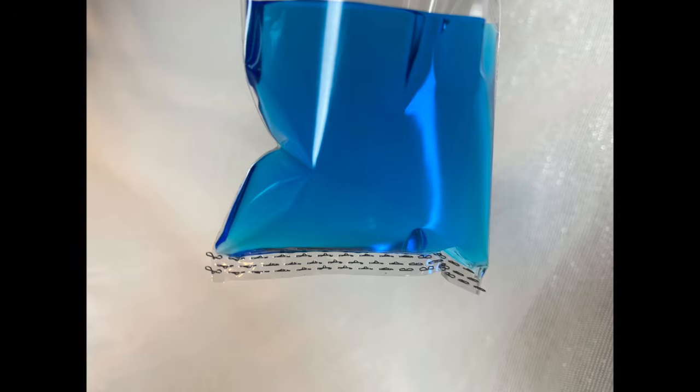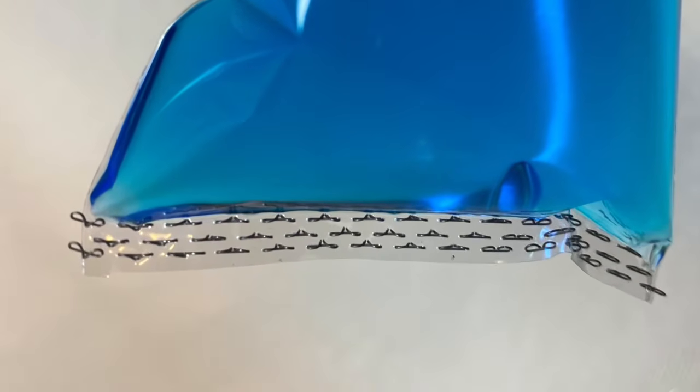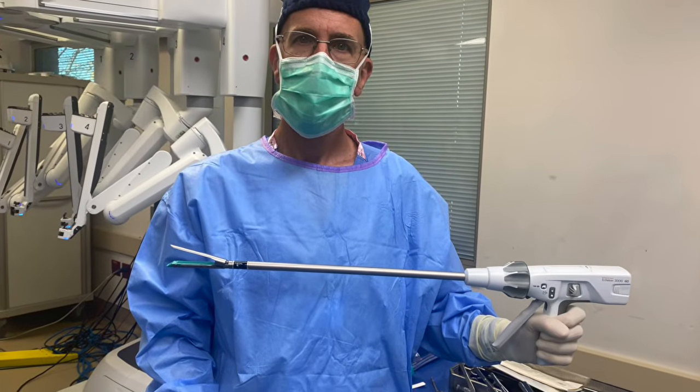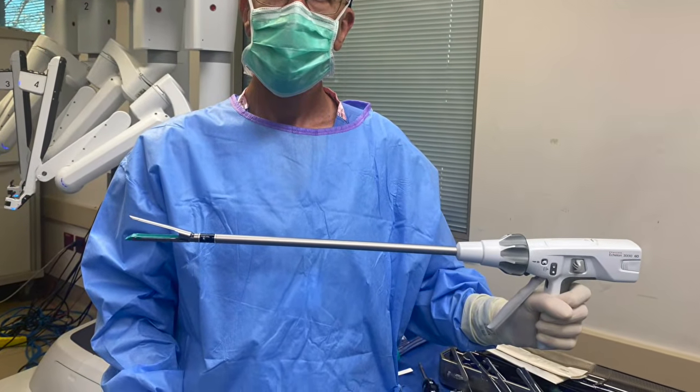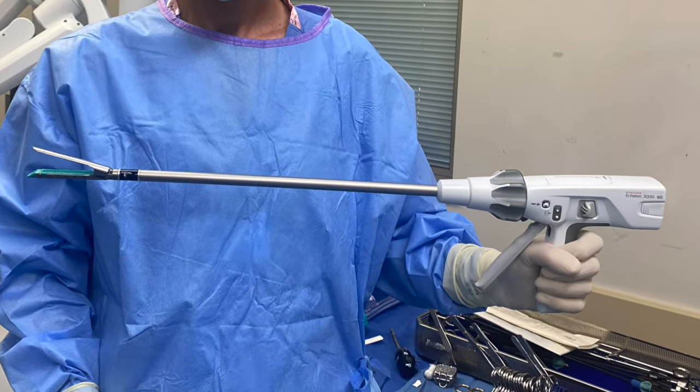Now, to show you how well sealed it is, I'm going to pour some blue fluid in the bag, and you can see up close here the 3 rows of staples overlapping, and the fluid is staying within the bag and it's not leaking out. And this all happens within a matter of seconds. Some amazing engineering going on here. So this is how we seal and divide the bowel laparoscopically.